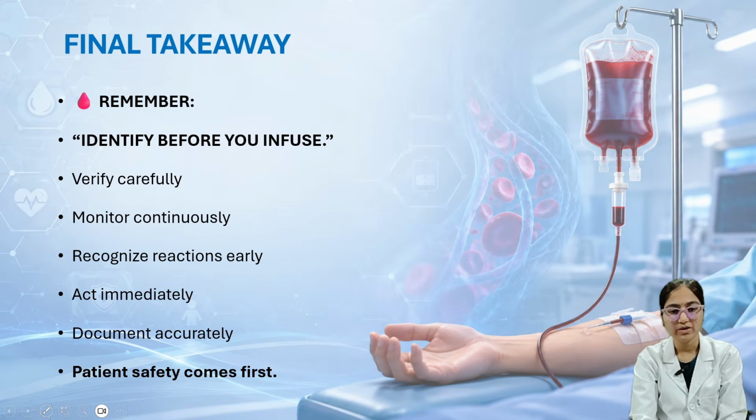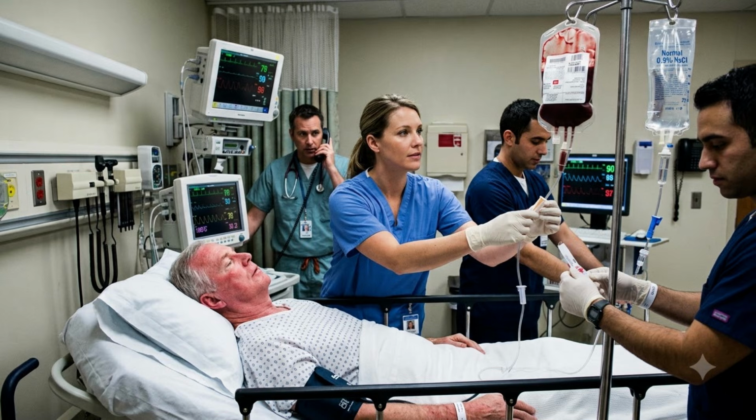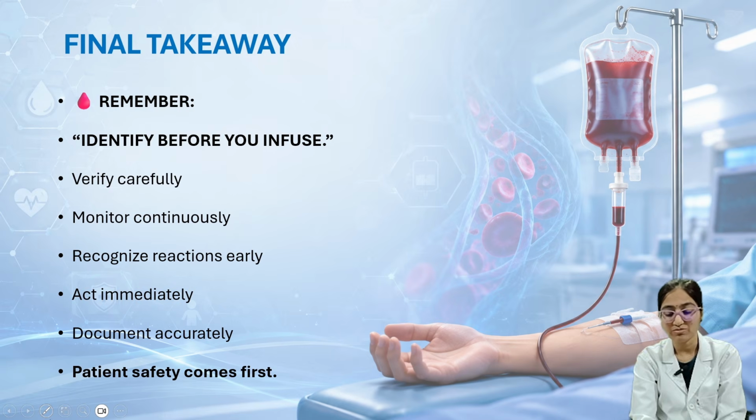And then here, final takeaway. We need to remember, identify before you infuse, verify carefully, monitor continuously, and then recognize reactions early, act immediately, and then document accurately. Here, patient safety comes first.